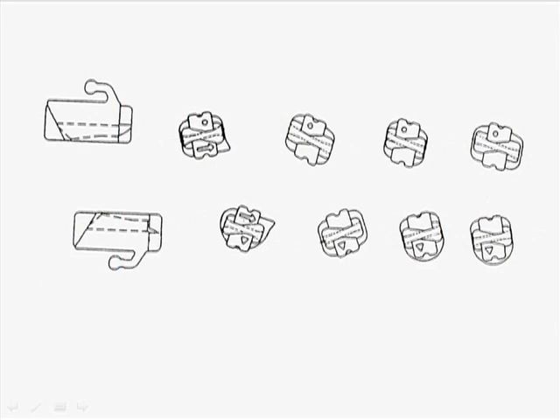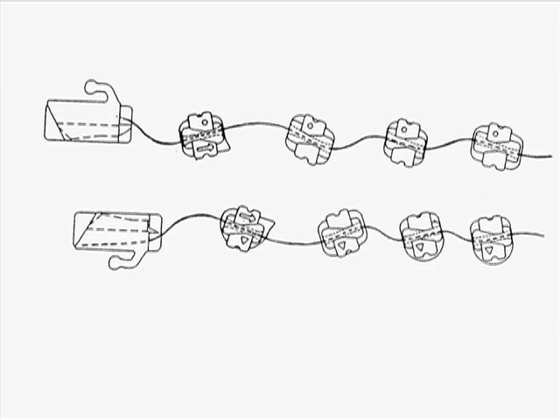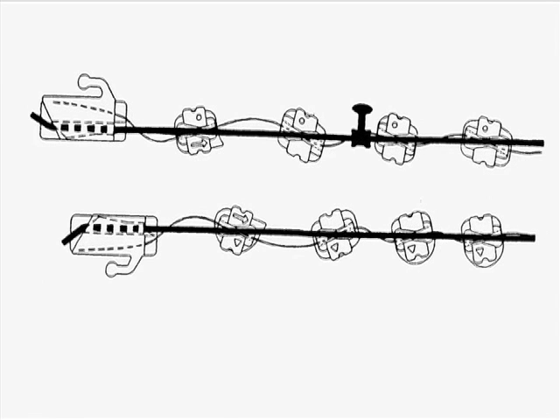At the beginning of the finishing stage of treatment, the super-elastic wires are threaded through the deep tunnels. In this demonstration, we are threading from the mesial through the tunnels of the right central incisors. Nickel titanium 0.014 inches is used. The full-size stainless steel arch wire is then engaged in each arch wire slot and retained with conventional elastomeric ligatures. The upper anteriors are tipped distally, caused by retraction during space closure and/or the correction of class II interarch relationships. The opening of anterior overbites with Kesling slots also results in distal crown inclinations.